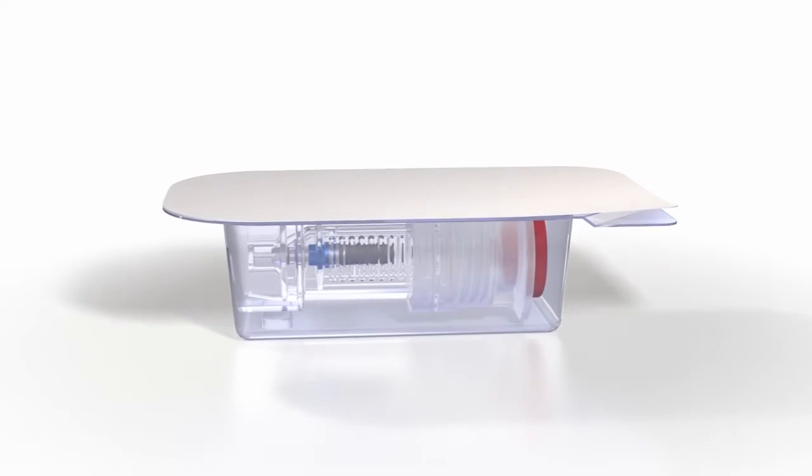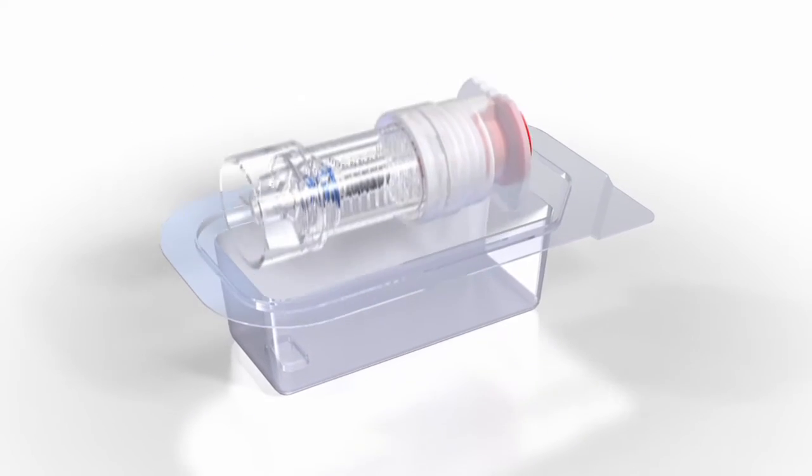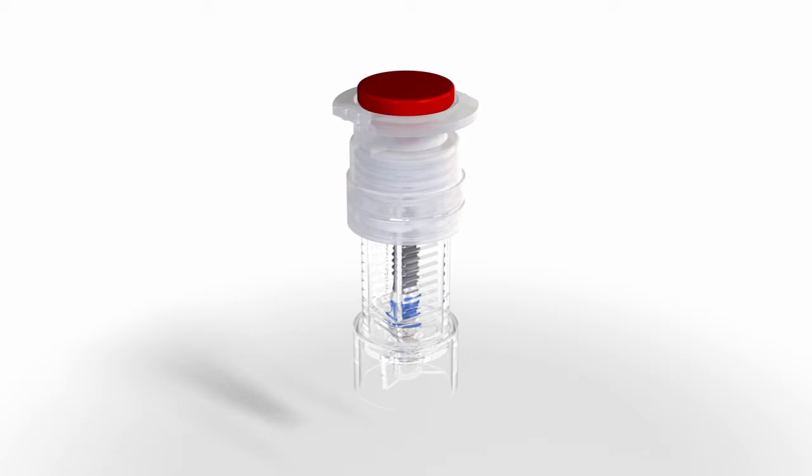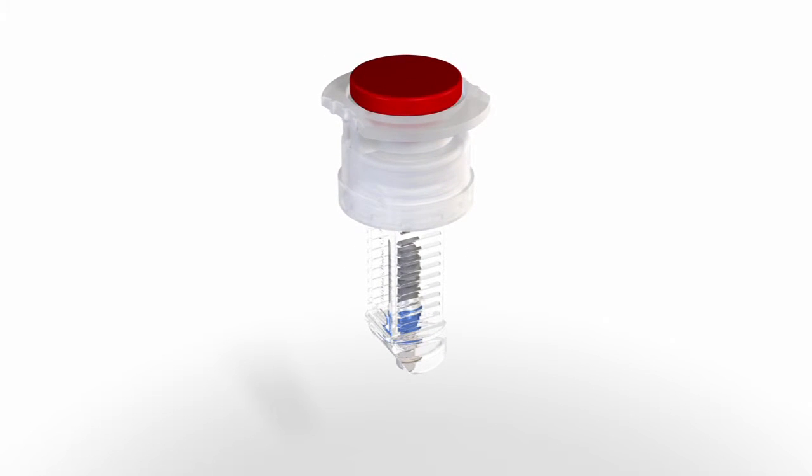For a Straumann SL active implant, the blister is opened and the vial is removed. The blister ensures the sterility of the implant. It should not be opened until immediately before implant placement. The implant carrier is detached from the lid by pulling it off by hand. After removing the implant from the solution, the chemical activity of the SL active surface is ensured for 15 minutes.